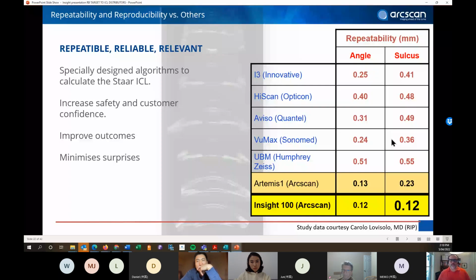That is one size of ICL. And when you are off by one size in ICL, you can have a pupillary block. You can have an oversized lens, or you can have an undersized lens, and you're going to have a problem, especially with the oversized. That's where the problem is when we're talking about hyperopic lenses. I know the hyperopic lenses are not famous in China. We mainly have myopics, but we do have a high incidence of angle closure glaucoma in China.